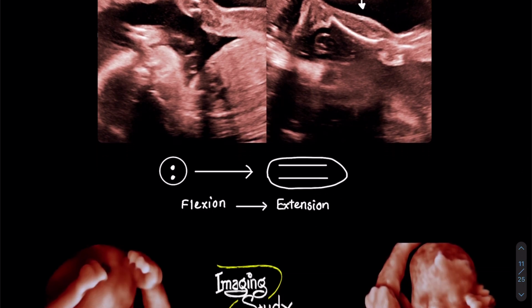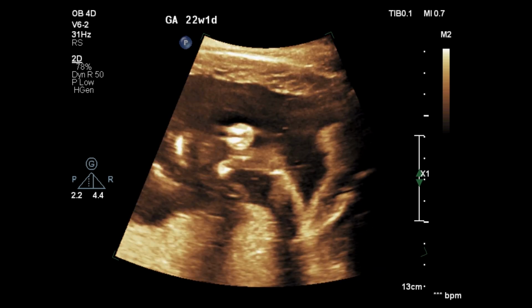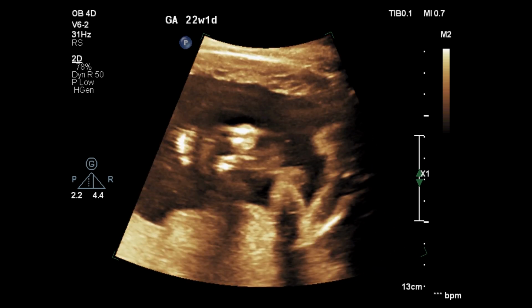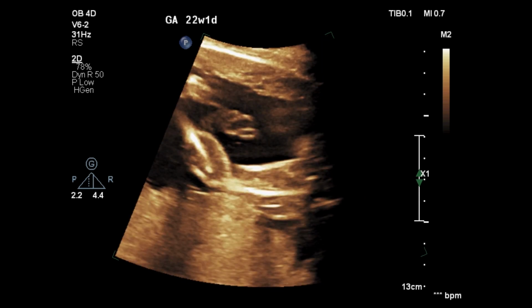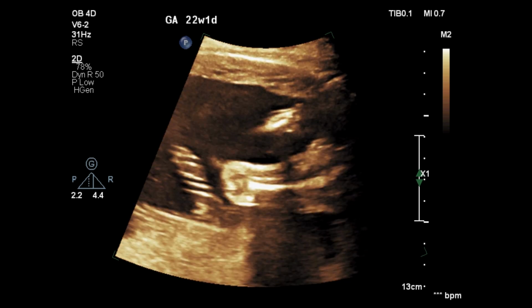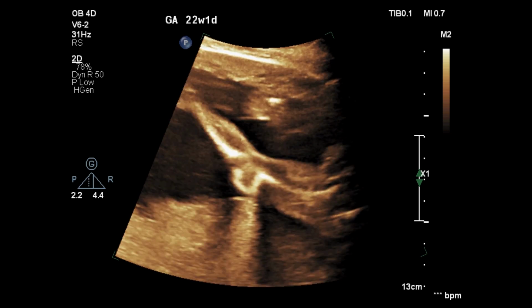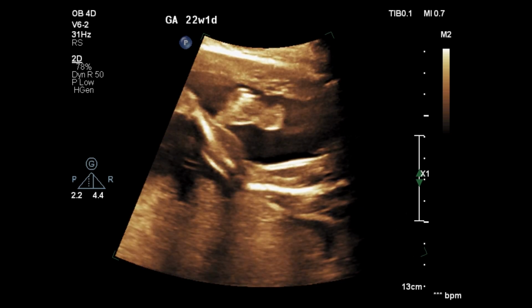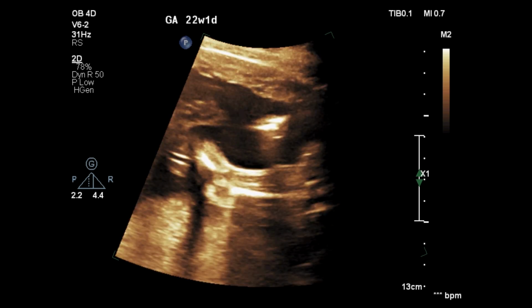Let's see on real time. First one, foot and legs are seen, knee is flexed. And it is extended now. Again got flexed. Again fetus has extended the knee and flexed. So now you have to practice a lot to identify these views.